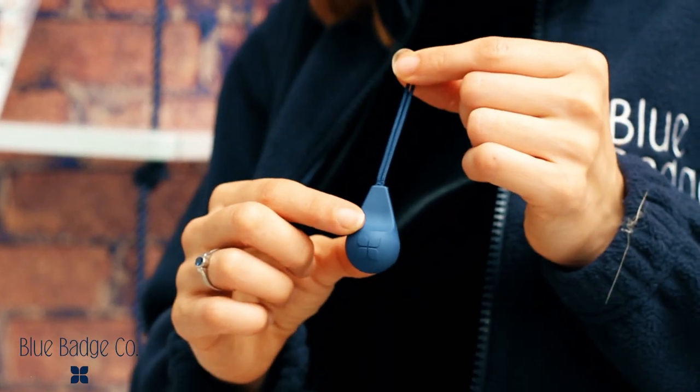I'm Ellen from Blue Badge Company and I'm going to introduce you to our range of dressing aids, making simple tasks that are a little bit easier. These are our zip pulls. They are strong and durable and aid with pulling any zip.